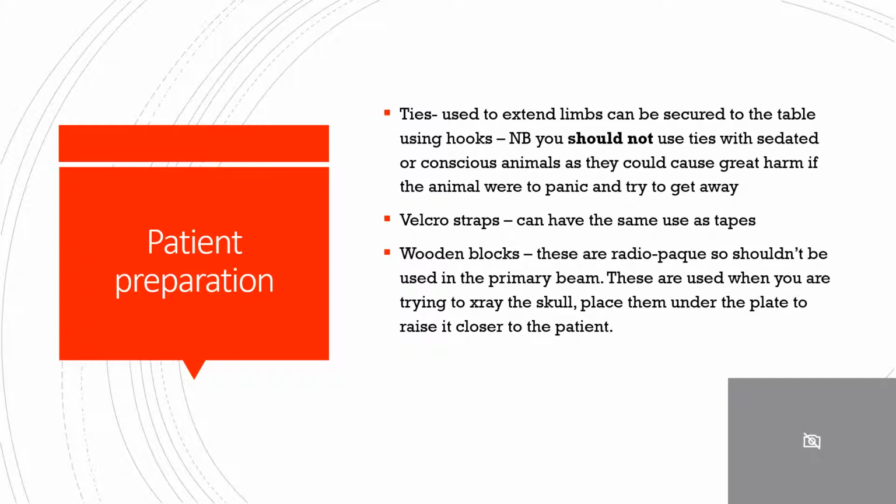Velcro straps have the same use as tapes. Wooden blocks are radiopaque, so shouldn't be used in a primary beam. We can utilise them when you're trying to x-ray the skull, for example. We place them under the plate to raise it closer to the patient. Wooden blocks aren't so commonly used in practice nowadays, however it might be something that you use on the odd occasion.